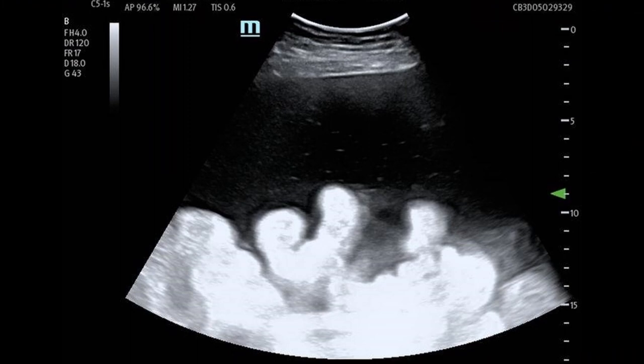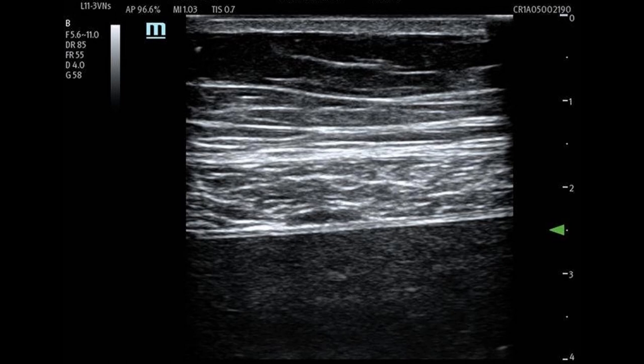Here is an example of ascites with a suitable pocket to perform a paracentesis. This is an actual patient where I placed the probe fairly lateral on the abdominal wall. However, at this exact site, I changed my probe from a curvilinear transducer to a linear transducer, and this is the image that I obtained. Notice the abdominal wall, the peritoneum, and the inferior epigastric vessels directly in the location of my planned needle path.